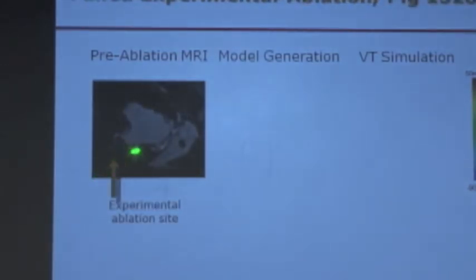And then it turns out in that particular animal, for whatever reason, we really missed. Because you see this kind of area right here. So here's the cross-section. There's the lateral wall. There's the septum there. There's the right ventricle there. And here's this kind of funny-looking area here. You see this kind of white rim here, which looks surprisingly similar to this area over here.